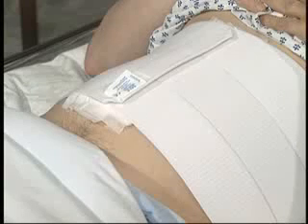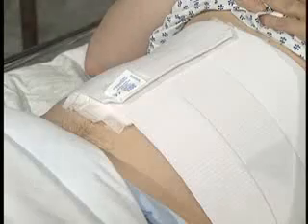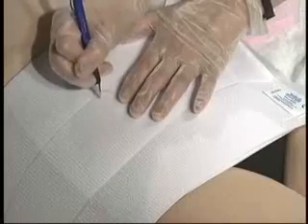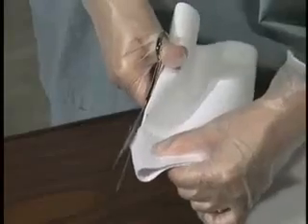Begin by resting the binder over the drainage site. Be sure that the material is laying flat and that it's not doubled over. Mark the fabric vertically where the hole will be made. Crease the fabric and make a very narrow elliptical cut in the material. When the fabric is stretched, the cut will become a round hole.